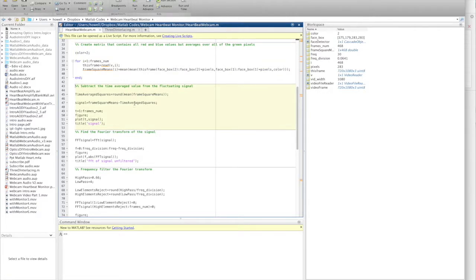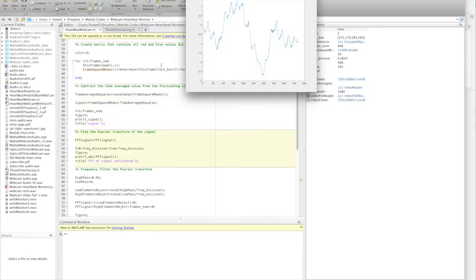We want to subtract the average value of 140 so that we can amplify the changes. Let's run in advance. You can see what the fluctuation signal looks like. These spikes are the heartbeat. These other slow or fast changes may be interesting physiological processes, but we are not going to worry about them. We will filter out these frequencies using the Fourier transform.